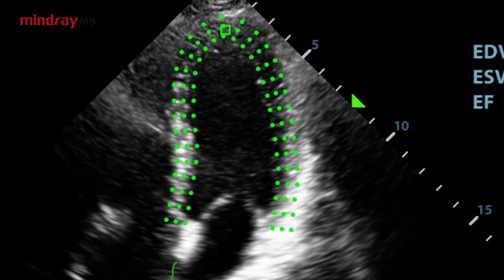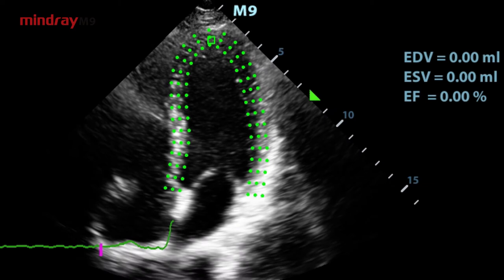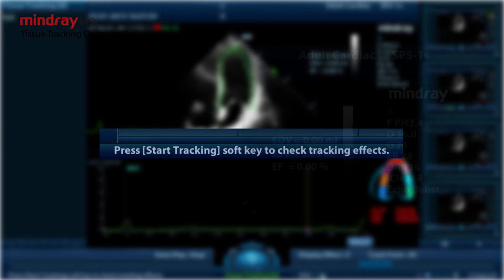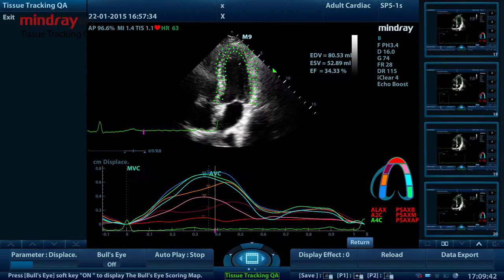If the cycles are not adequate to provide the information, switch to another cycle trace. Click start tracking on the soft menu to start the tracking. Adjust the parameters if necessary.